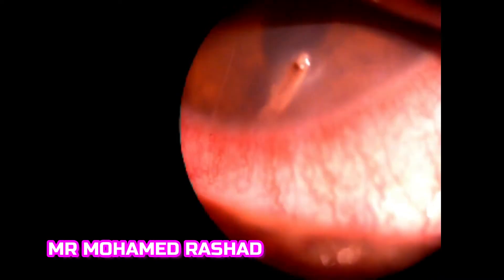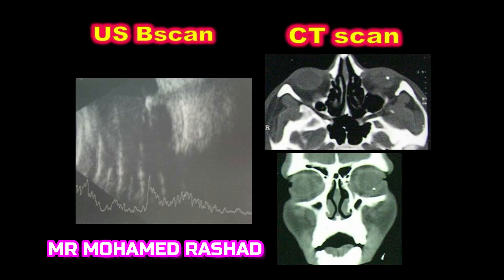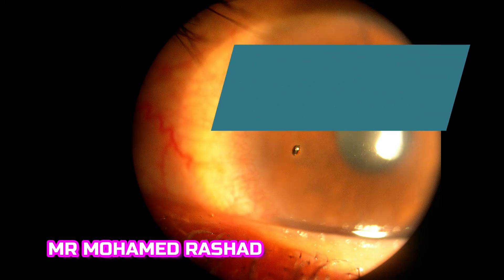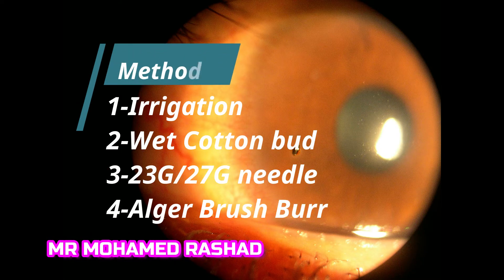This is a wooden foreign body that penetrates the full thickness of the cornea and needs to be removed in the operating theater. Anterior segment OCT can give you a very good idea about the depth. Ultrasound B-scan and CT can exclude other intraocular foreign bodies.